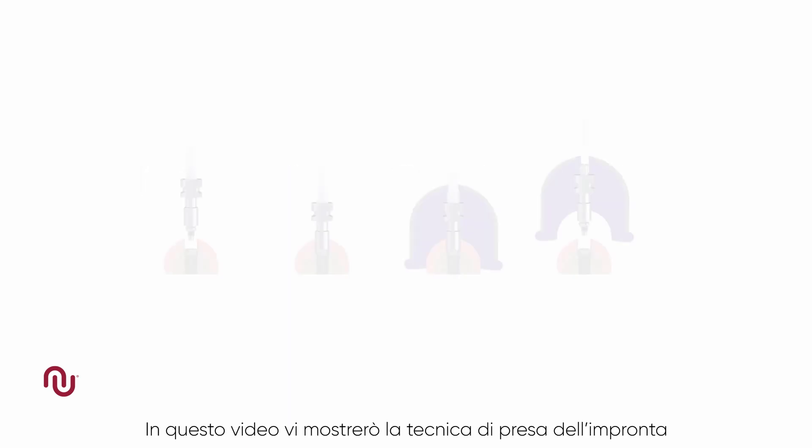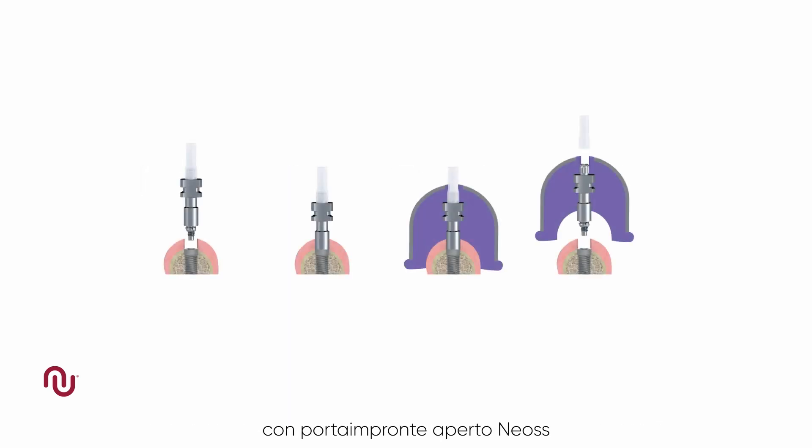In this video we will demonstrate the use of the NEOS open tray impression technique. In an open tray technique, the impression coping is picked up in the impression material.